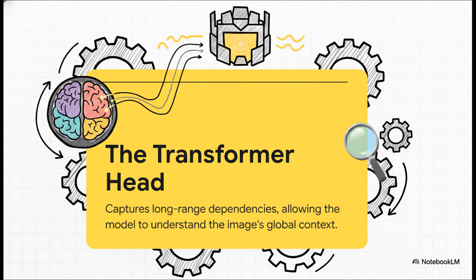And the final, crucial piece of this puzzle is the transformer head. This is the part that allows the AI to step back and see the big picture. It's not just looking at tiny little patches of pixels in isolation, no. It's understanding how different parts of the brain scan relate to each other, even if they're far apart. This gives the model that all-important context, just like a human doctor would.